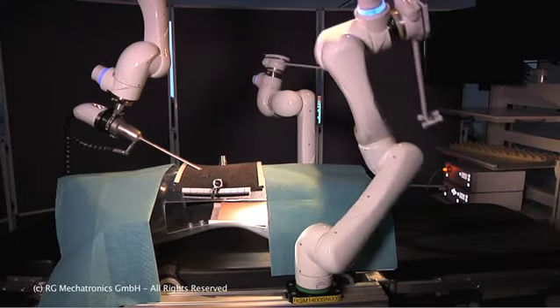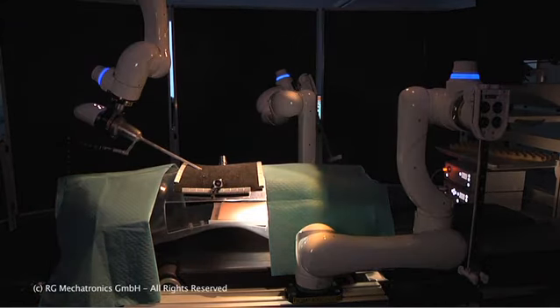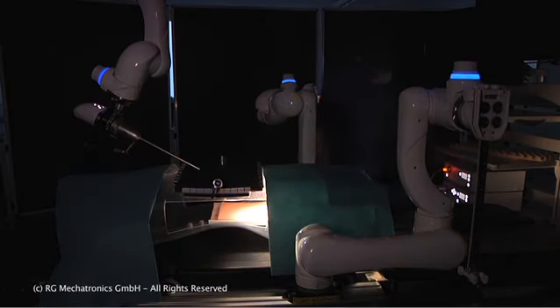After the operation, the robots and the tools are extracted from the patient, and the robots can drive back to their parking position.